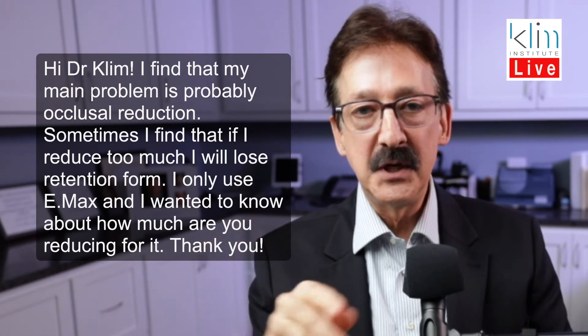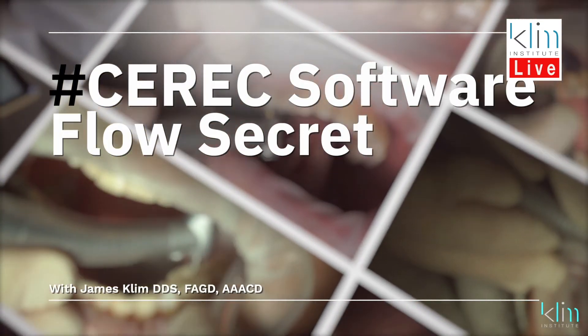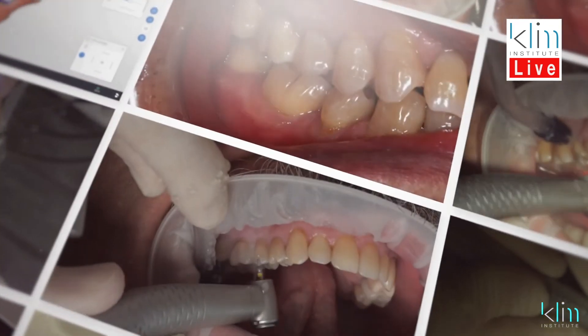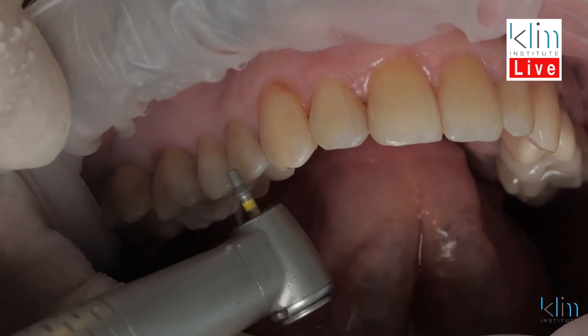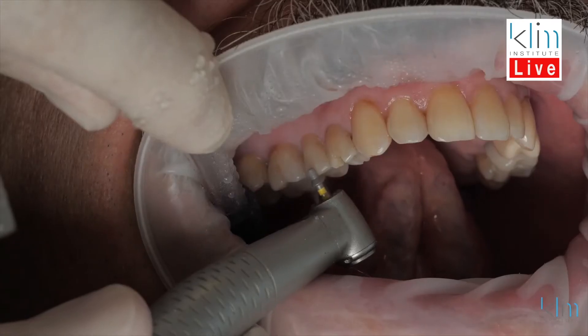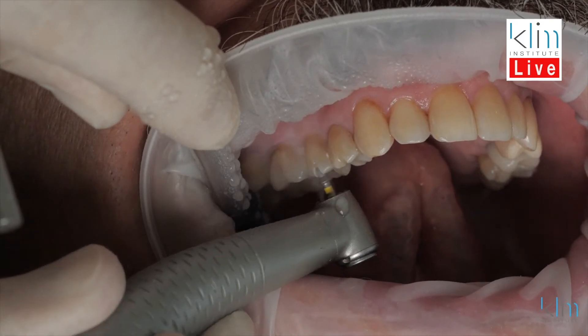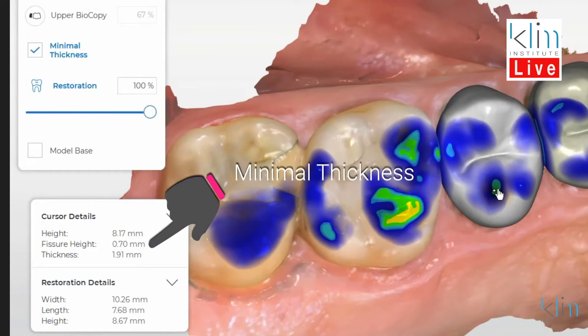Let's go through that video on occlusal reduction. One of the secrets to making the software really flow is how we prepare, and more of it is about occlusal reduction. If we have enough occlusal reduction for the material we're using, the software proposes very, very well when you're using biogeneric individual — I can't overemphasize that. I've been practicing dentistry for 36 years and still occasionally have to go back and add more reduction to the occlusal table of my preps.